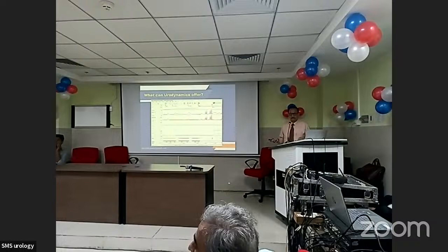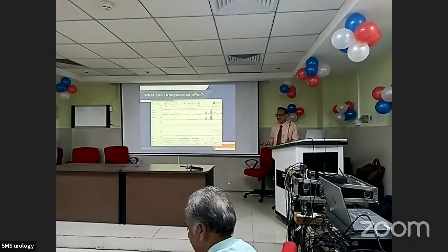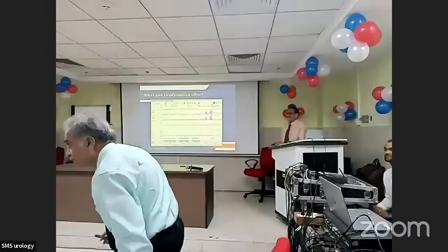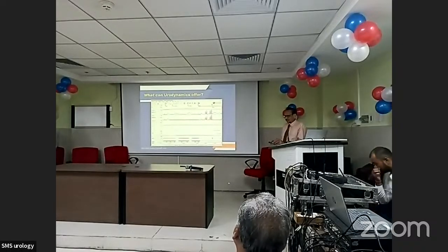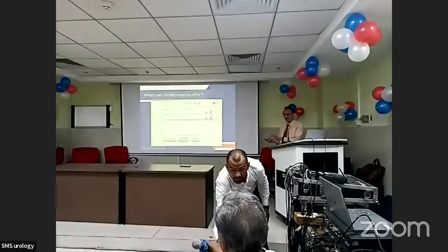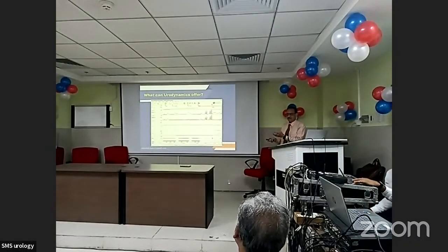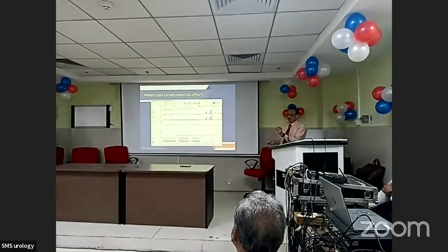In case of asymptomatic detrusor overactivity, we have to see the EMG activity also at the same time. If you do EMG in the non-neurogenic case, with normal innervation, you should expect a reflex relaxation of the pelvic floor and the external sphincter in response to the contraction. So EMG may show relaxation.